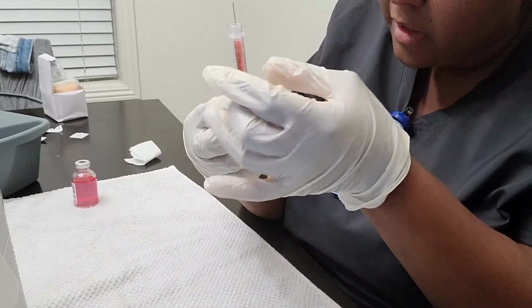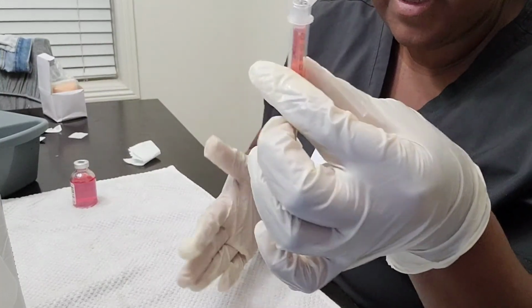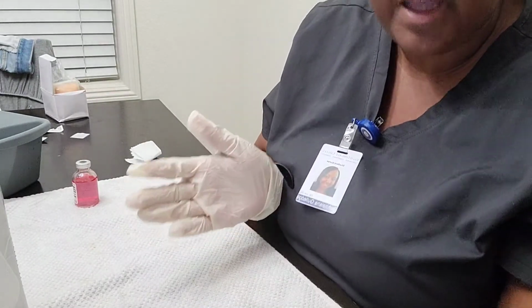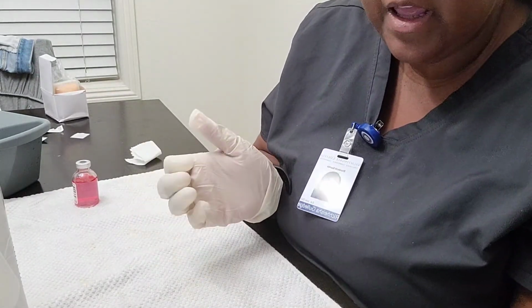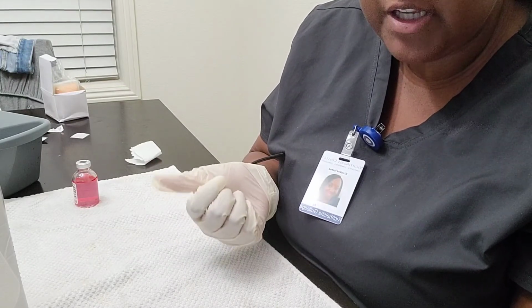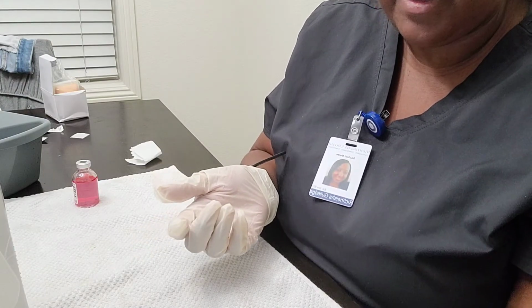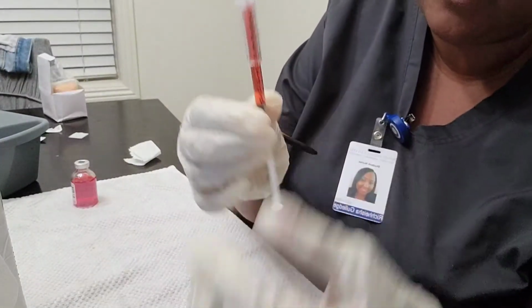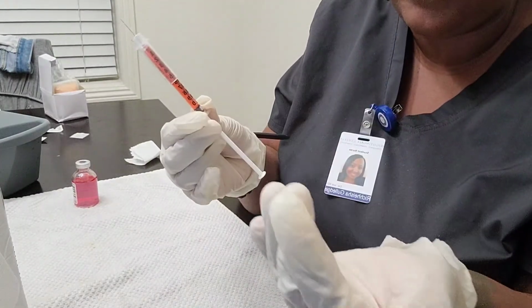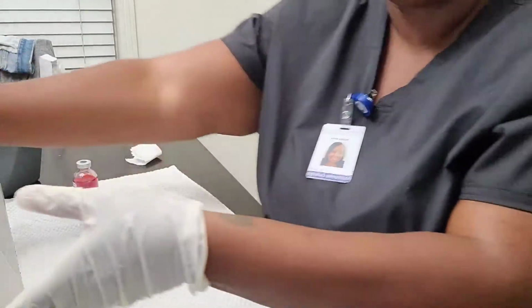All right, so I will go ahead and I got rid of any bubbles. So then before I will go ahead and check the EHR again, and just make sure that I got the correct medication, the medication dose again, and making sure that it's the correct dose and amount. Again, I don't have the correct size. So I'll put that aside.